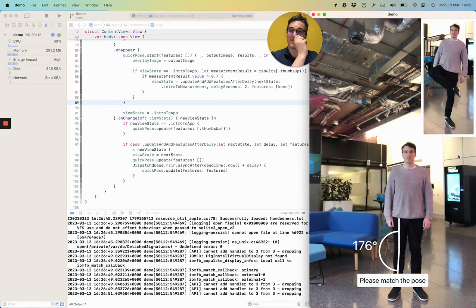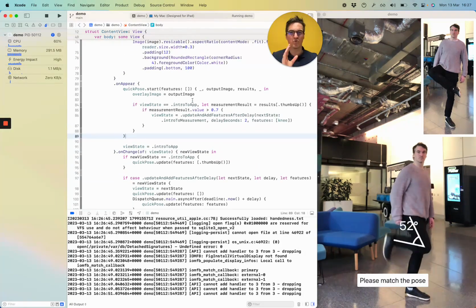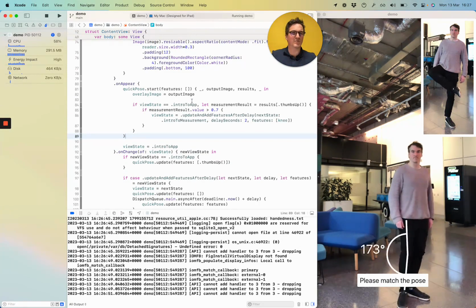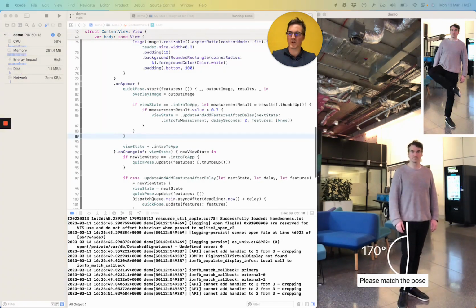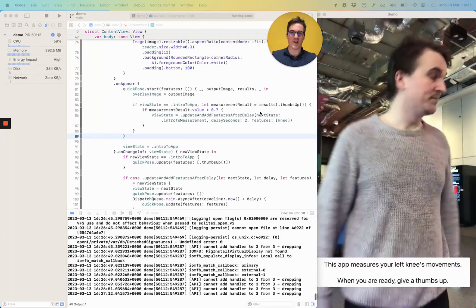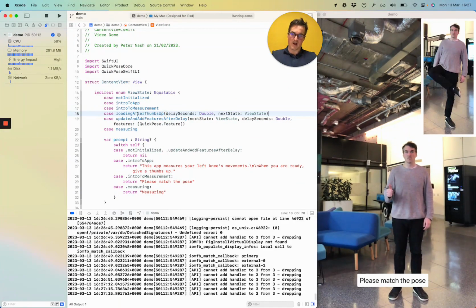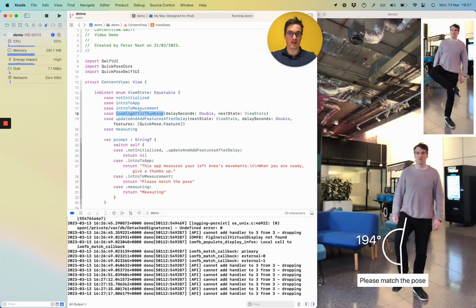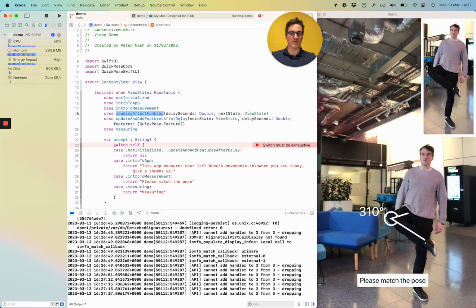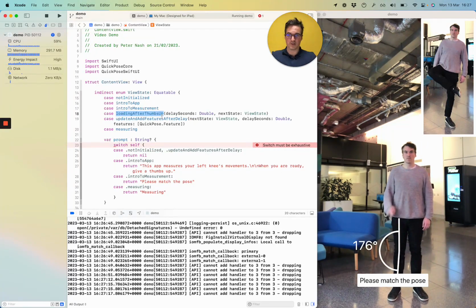It felt generally quite quick and janky though. There's something about if something's too quick, then it kind of feels a bit strange to the user. So I'm going to add a new meta state in. So we had before the kind of update and add features after delay. I'm going to add a loading state. So anytime we get a kind of thumbs up, we kind of wait for a bit and give the user some feedback.